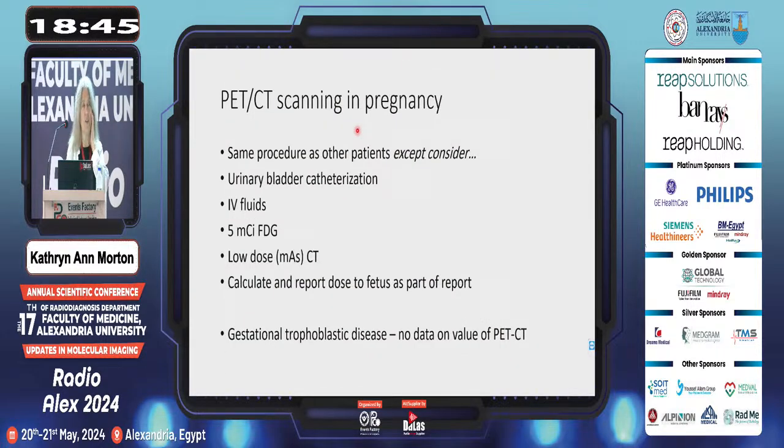I'm going to conclude with just mentioning PET-CT scanning in pregnancy. Basically, you use the same procedure as other patients, with a few exceptions. First of all, it is a safe procedure in pregnancy. It has not been associated with any reported cases of bad outcome to the fetus. Nonetheless, I think it's important to use precautions to further reduce radiation to the fetus.